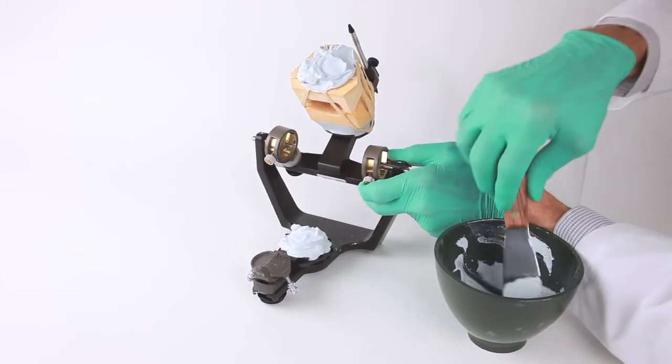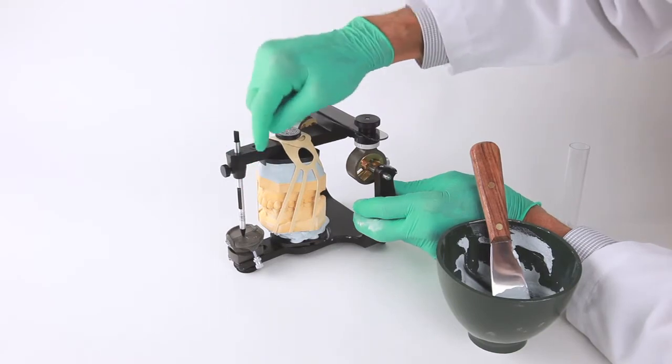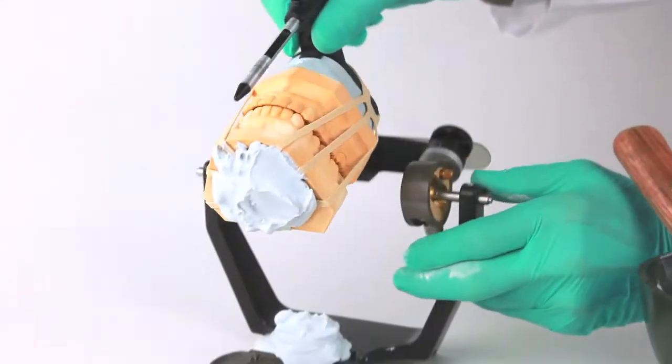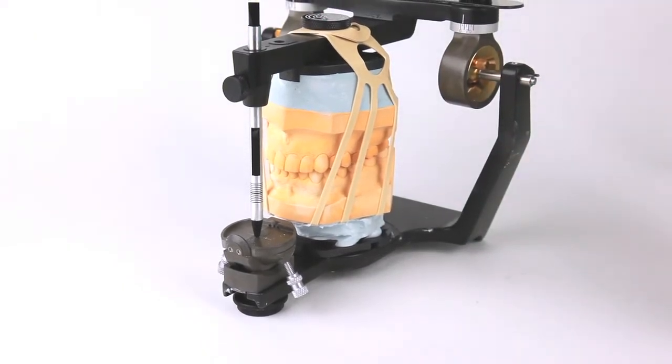Once an adequate amount of mounting stone is in place, the articulator arm is then closed. Light tapping on the upper articulator arm is recommended to make sure the incisal pin is seated on the incisal guide table.